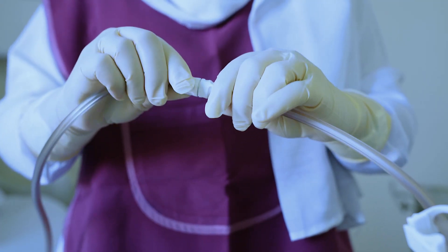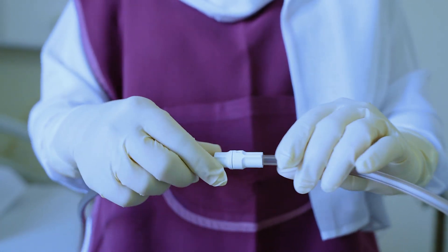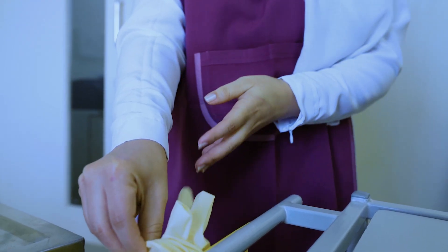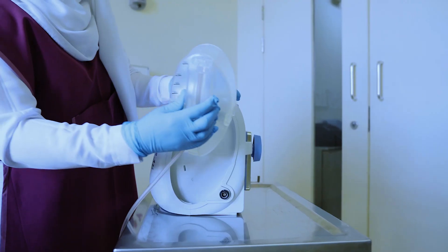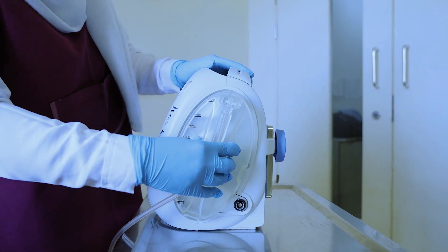Attach the other end of the VAC tubing to the VAC canister. Remove the sterile gloves and perform hand hygiene. Put on clean gloves and attach the canister to the VAC machine.